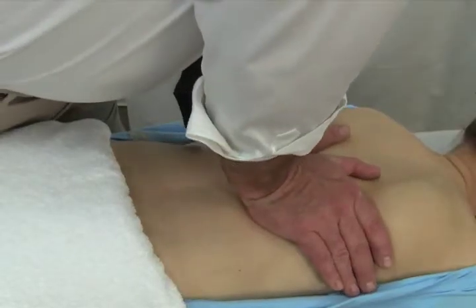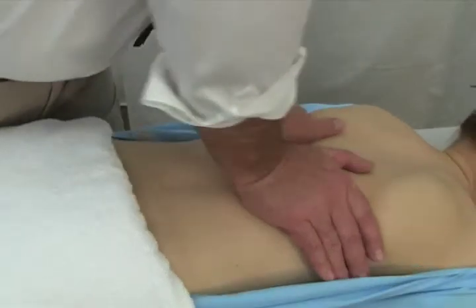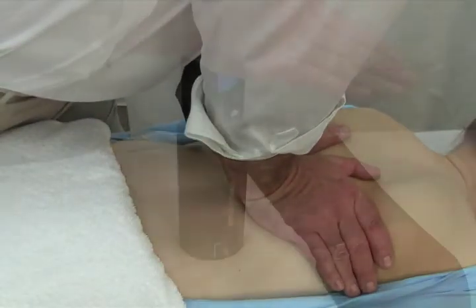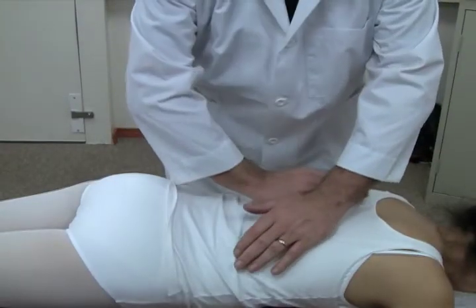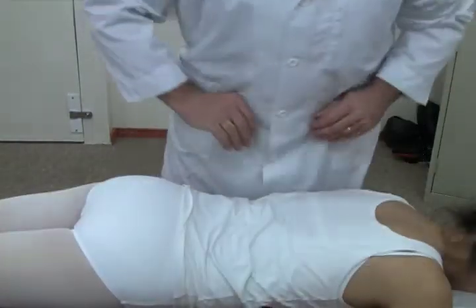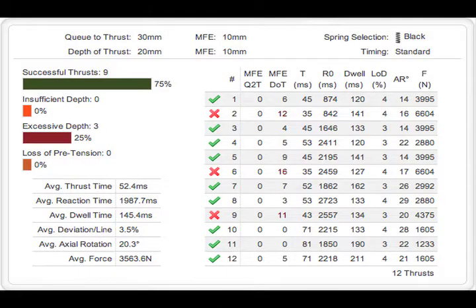Because this exercise represents one of the more fundamental skills to be acquired, and because it lends itself to so many other applications, it is one that should be part of the rudiments of Dynadjust training. A natural enhancement for this exercise, to be assigned once the rudiments are mastered, would be the addition of rotational combined motion or torque. The professor would assign goal metrics for rotational torque for the exercise.